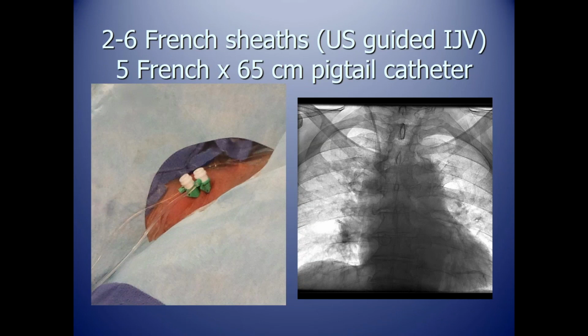Two, you are using thrombolytics and you are running heparin in, and different people use different protocols. I'll show you our protocol in a second. But patients can ooze from around the sheaths. When you have a jugular vein access and you sit them right up, the pressure drops, so you're going to really decrease your issues with oozing around the sheaths, as opposed to femoral. If it's a femoral vein, there's really not much to elevate. It's just a matter of putting pressure and extra dressings on the sheath if you're having an issue with oozing. So for those reasons, we typically use the jugular vein access.